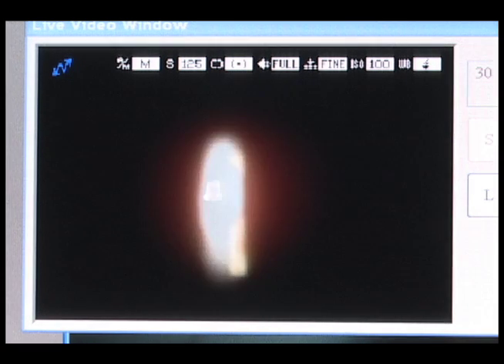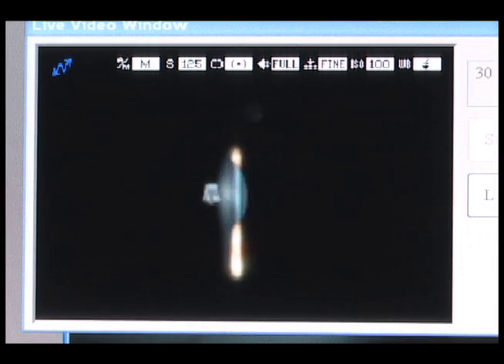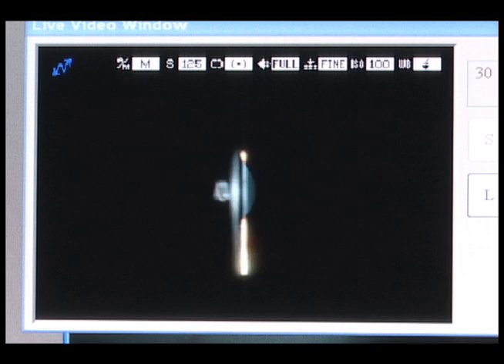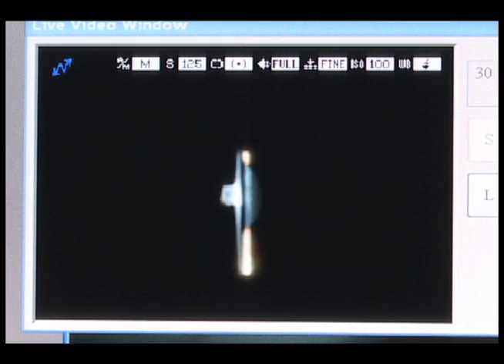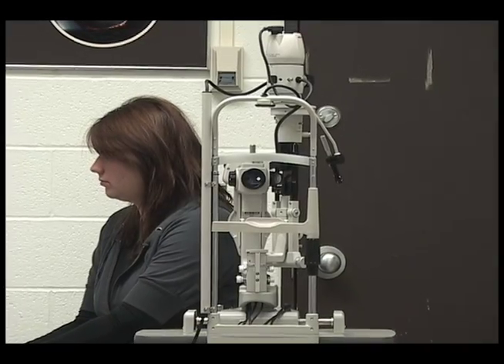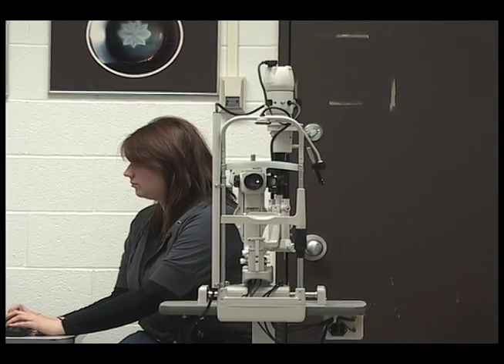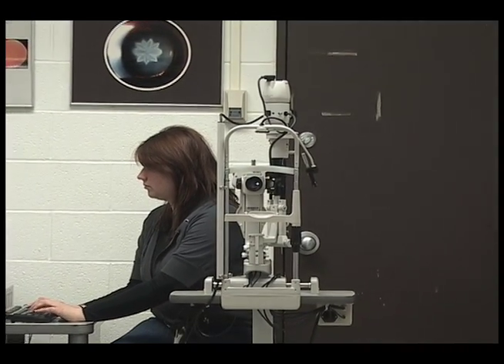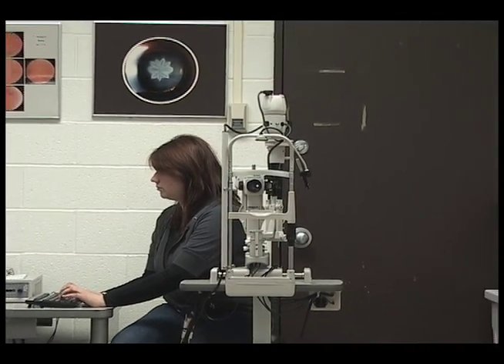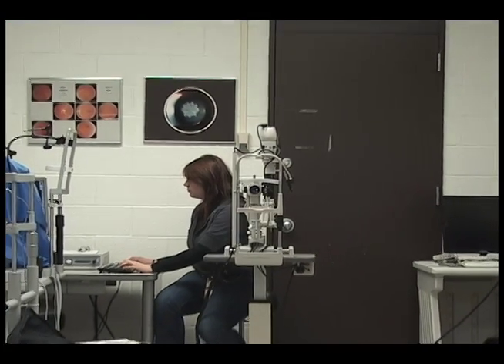Rock the tower towards and away from the subject until the light is in sharp focus. Now you should be able to jump into the photographer's seat and get a head start on slit lamp imaging.